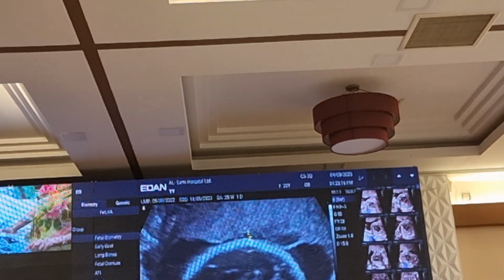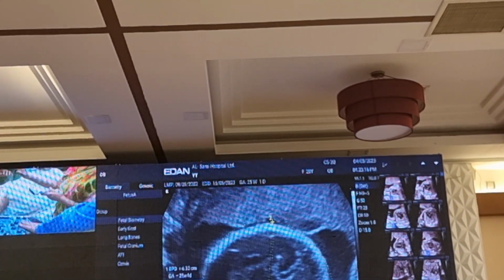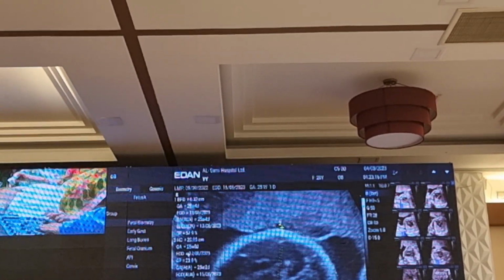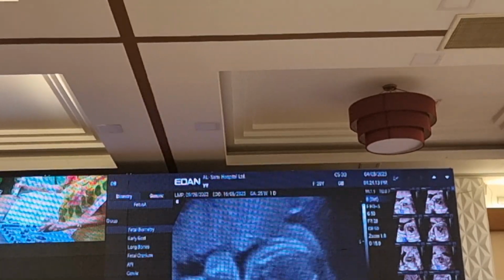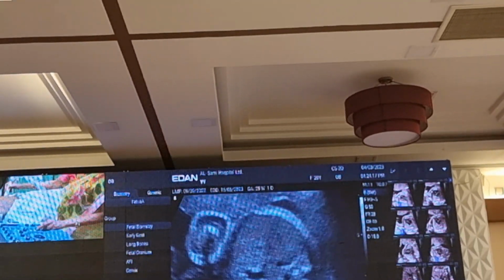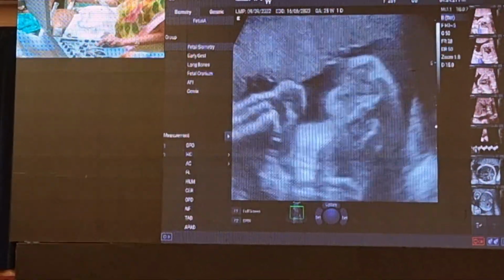So we'll just do that. I think the patient is a little uncomfortable, so I will take the... And then you freeze. After seeing this patient, a report has to be given, so we need to do a little something.